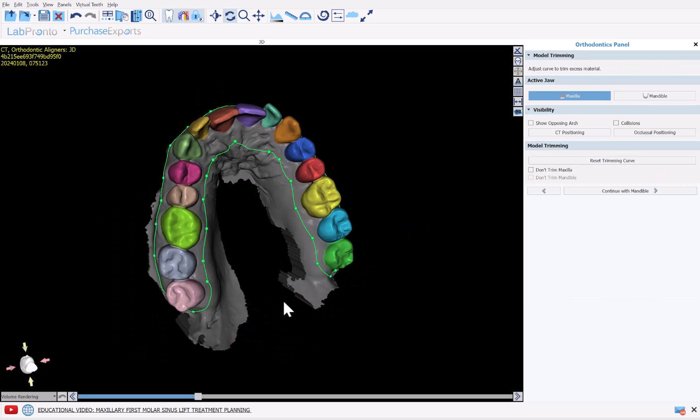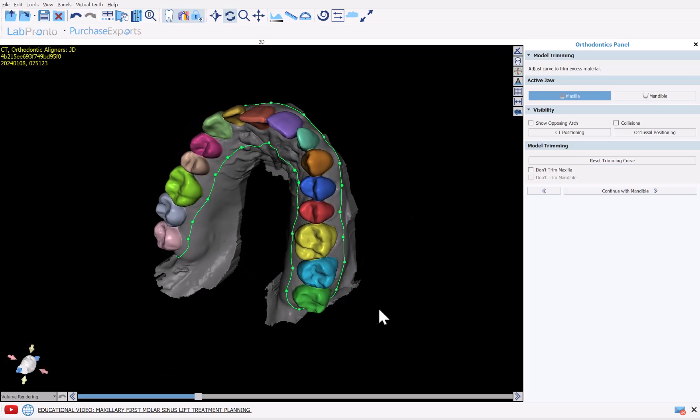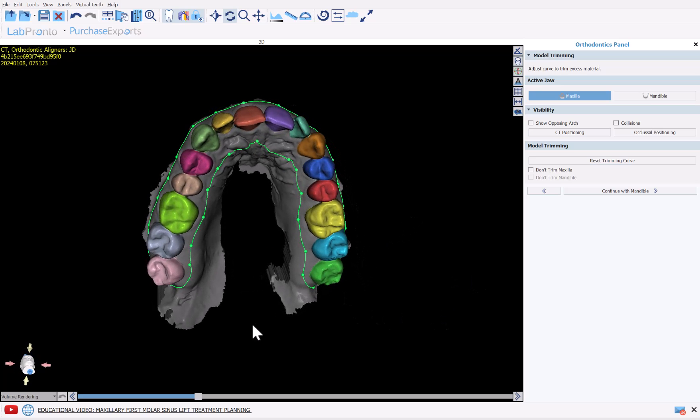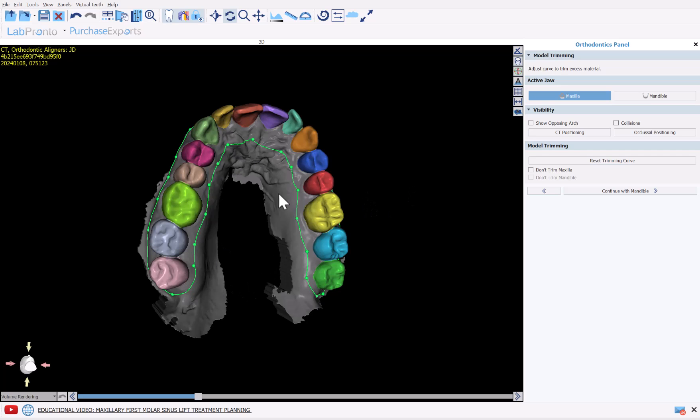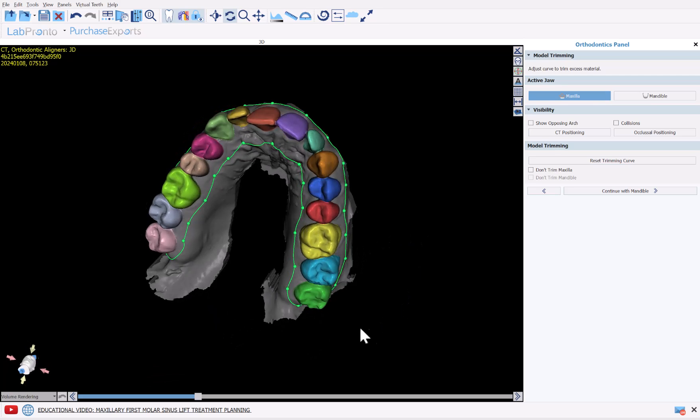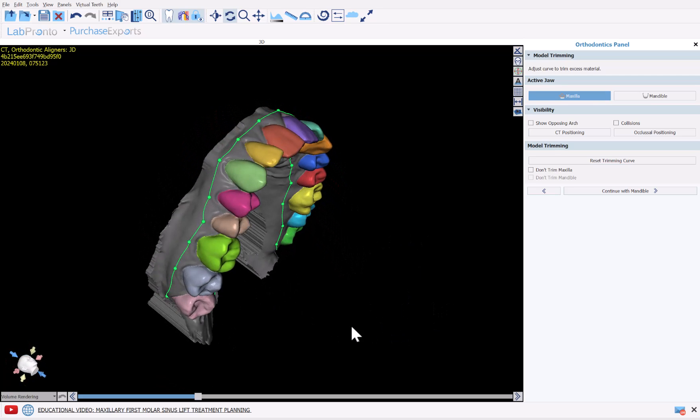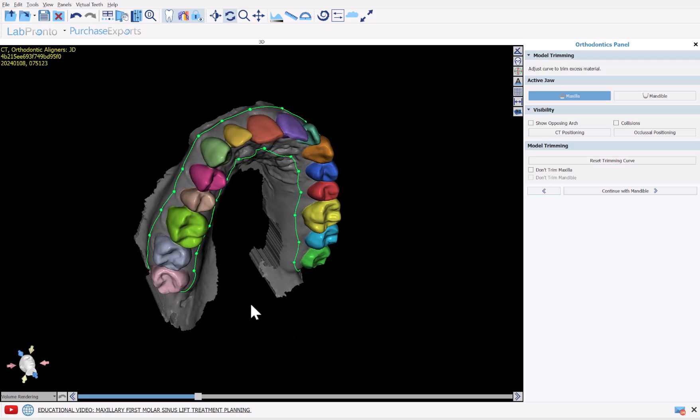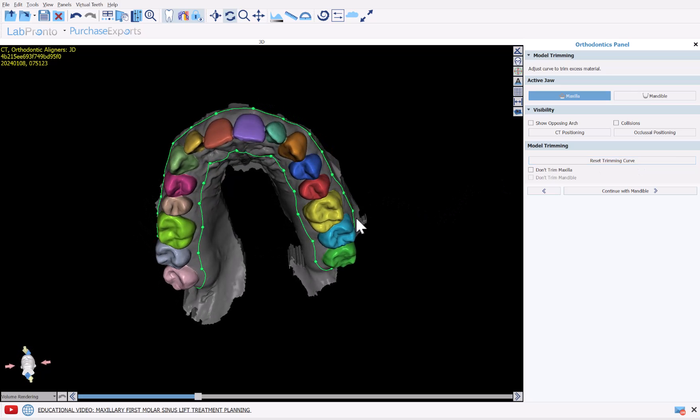The software now automatically places a model trim curve on the model. We could review the placement of the trim curve, modify accordingly just by grabbing and dragging any of the nodes if needed. Essentially everything outside of the curve, all this area here is going to be cut away. Any area within the curve is going to stay and be part of the model. So we're going to review the curve. If for whatever reason we don't want to trim, just click the box Don't Trim Maxilla or Don't Trim Mandible. If you make changes to the curve and you want to reset the curve to the automatic position, just click Reset Trimming Curve.